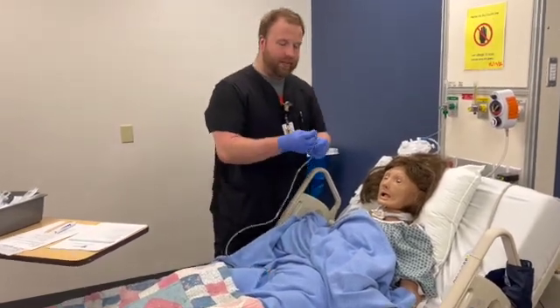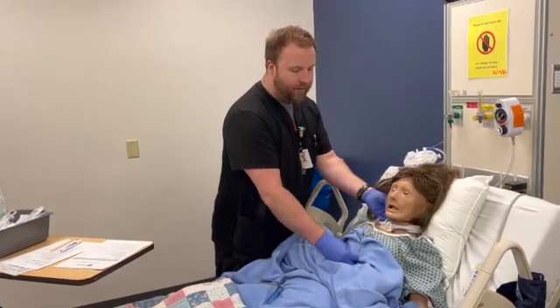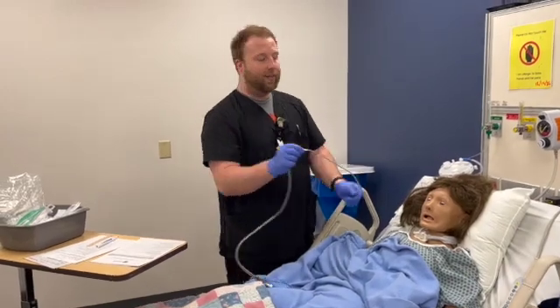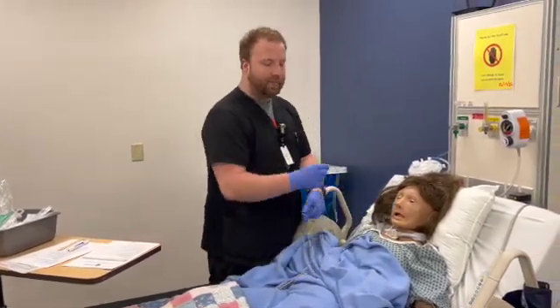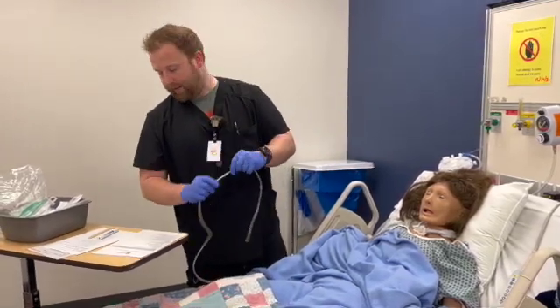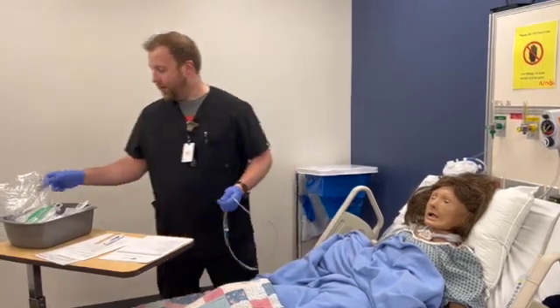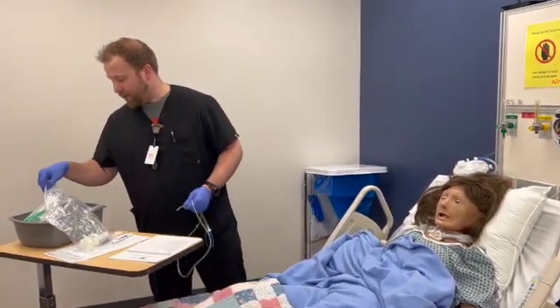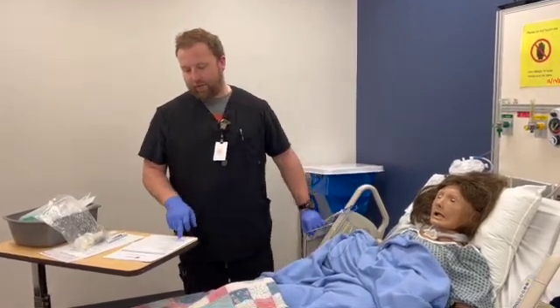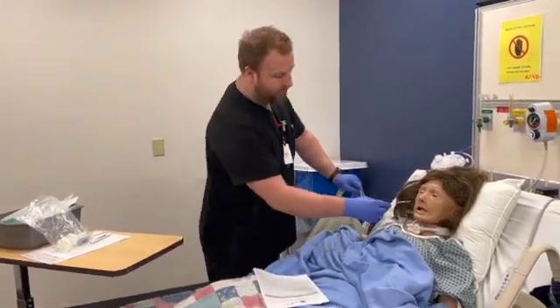We'll start the measuring. We're going to take the tip of the tube to the tip of the nose. We're going to go to the earlobe, and then we're going to work our way to the xiphoid process, and that'll be how far we expect to put the NG tube in. Usually I'll put a mark with a piece of tape, and we will get the patient a cup and an emesis basin. Then I want to lubricate the tube, and I'm going to insert.